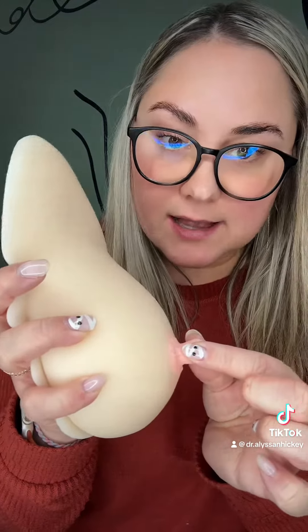The next thing to take into consideration when picking out a flange size is how elastic your nipple is. If you're pumping and a lot of that nipple is pulling in, you have more elastic nipples, so you're going to want to only size up one millimeter instead of two. And if you notice that it's not as elastic, then you can do the two millimeter.